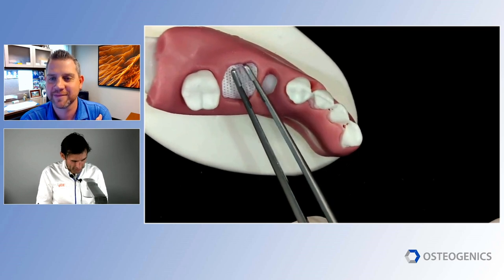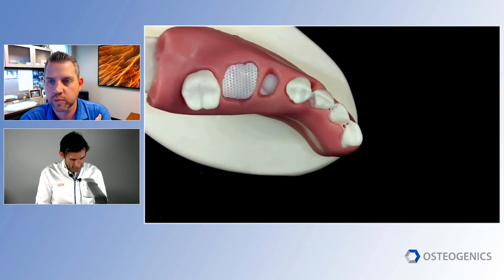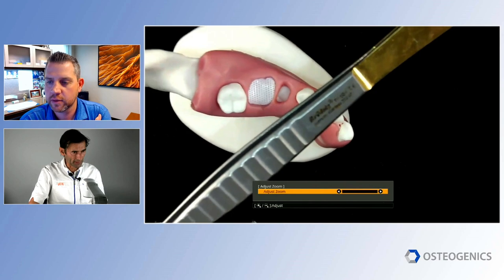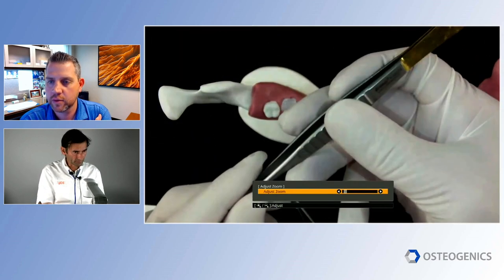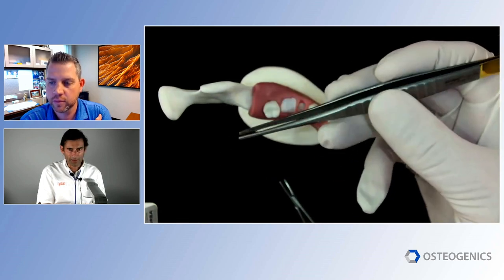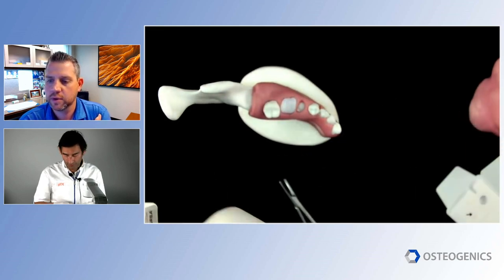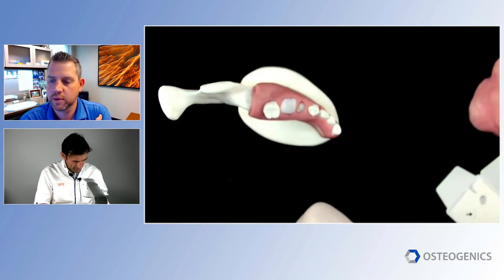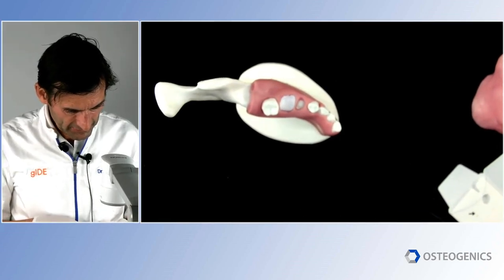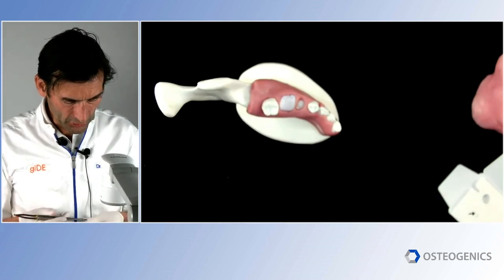But look how small these teeth are, right? Very, very atraumatic. The handle is not, I would say, the greatest. I would like it to be a little bit more ergonomic. It's still flat, but it works well. I've used this for 25 years. It came from cardiovascular surgery. And then I have other ones which are smaller for microsurgery. But it's a really important question to really use good tissue holders. Okay, so now we go to our closure here.